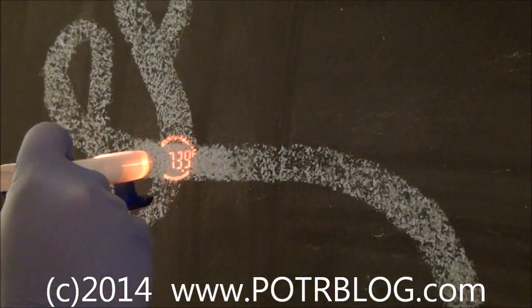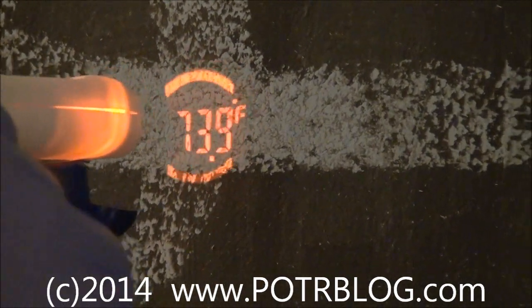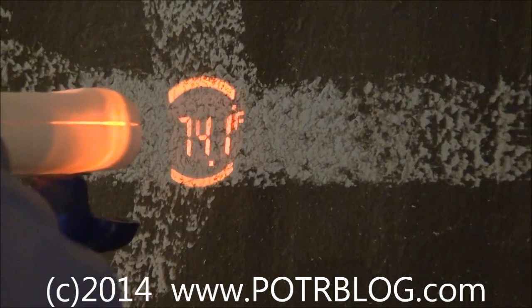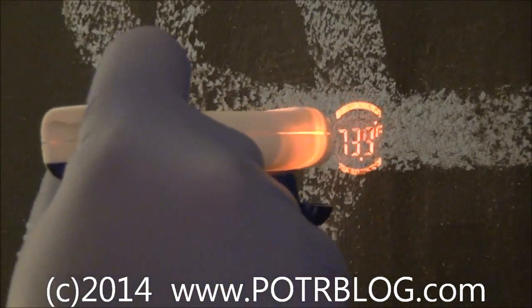Welcome to the Potter Blog site, August the 27th. Here is what we believe to be the best non-touch Ebola thermometer currently in existence. This is a Vizio Focus made by the people who make Thermo Focus.